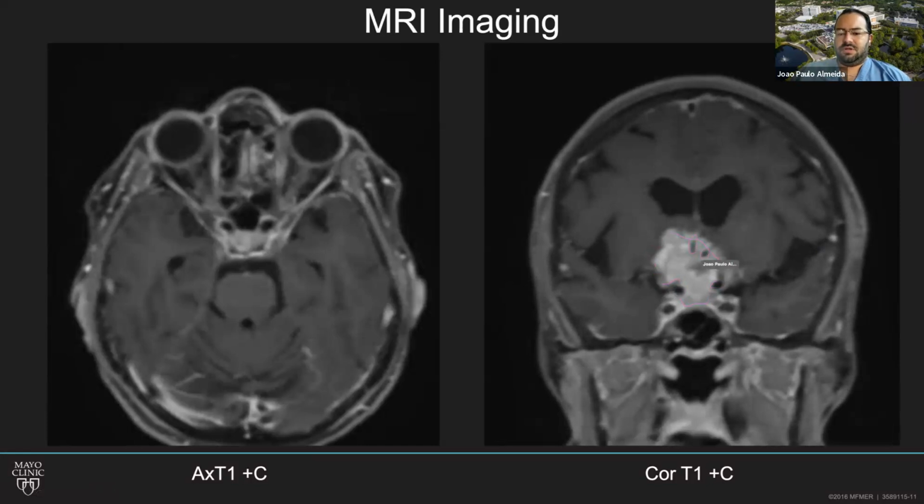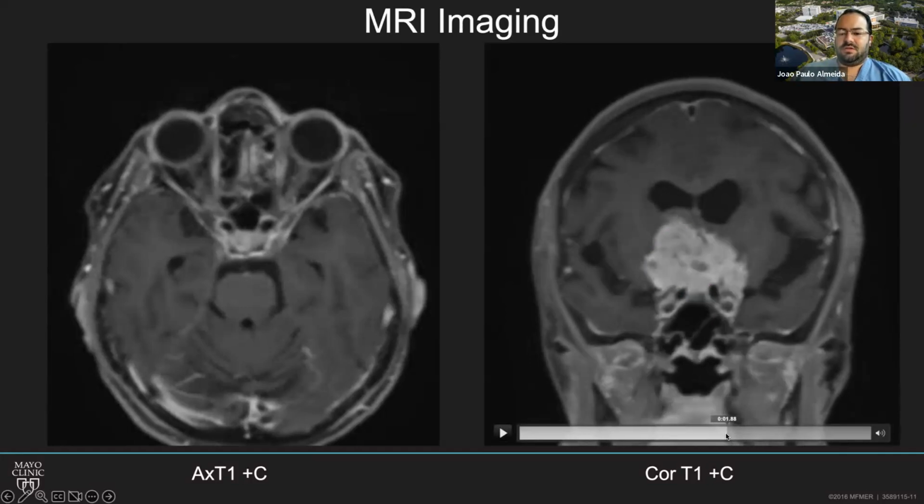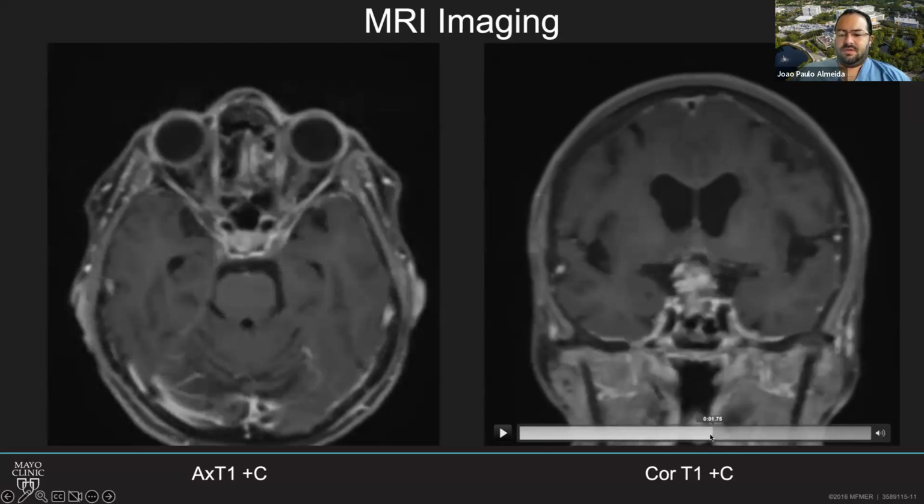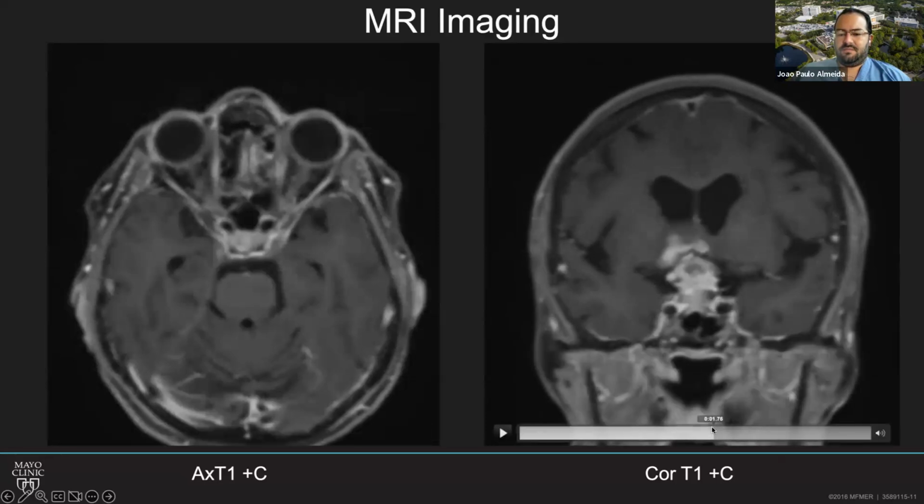Please continue moving the slides a bit. You can continue to see those black dots. Go ahead. The other way around, please. Very good. Stop. One back. One more. So what is this here? Communicating right in the midline. That's the anterior cerebral A1 segment on the right, A1 on the left, and then the anterior communicating artery here as the A-com. So it means that part of this tumor will be surrounding those vessels.